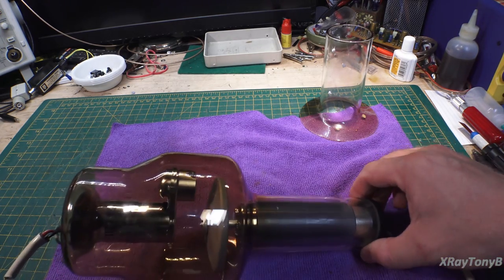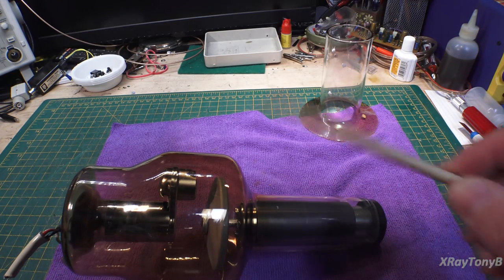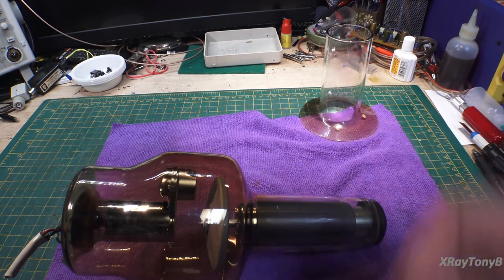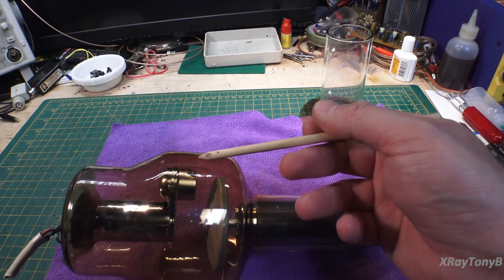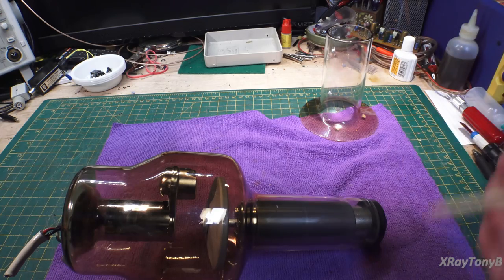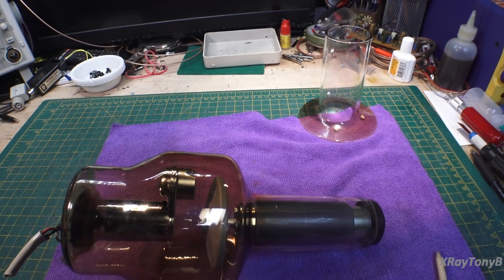This is what actually makes the X-ray. And no, it is not radioactive. I have a lot of people ask me that question. The only time that radiation comes out of this tube is when it's energized, when the voltage is applied to it. Any other time, it's just a tube. It's just a vacuum tube, and it doesn't radiate anything. In other words, when this thing is energized, it does not make the glass or the tube or anything radioactive. So that's one of the differences. So anyways, I just thought I'd share that with you real quick.